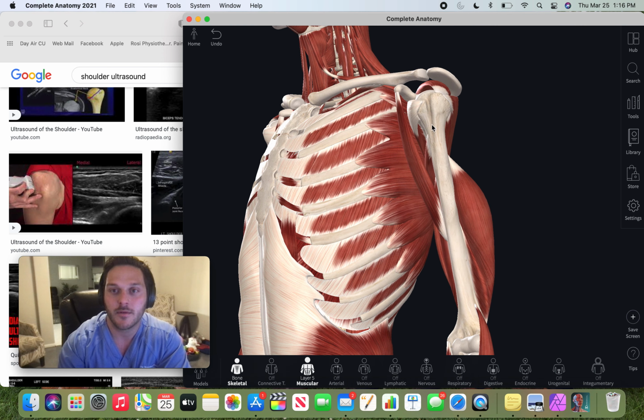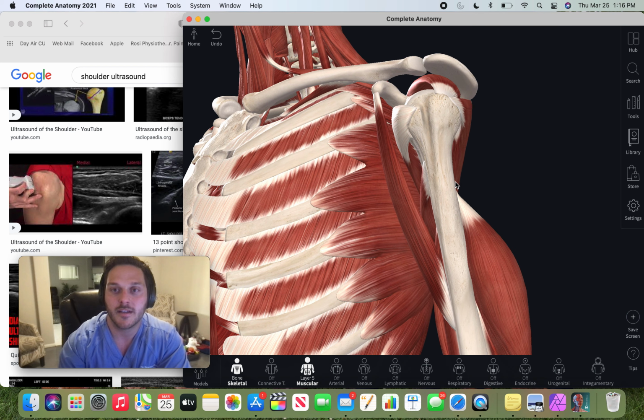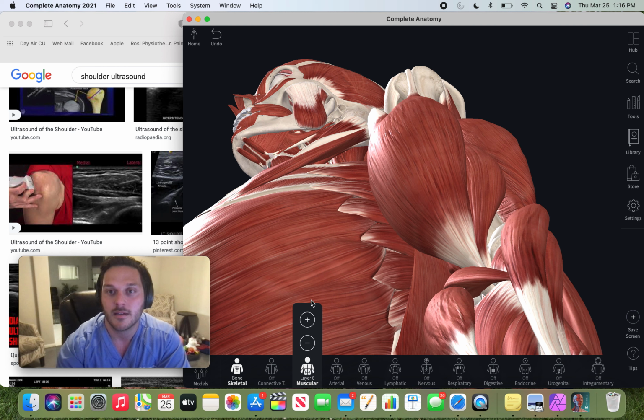So notice that we have our bicipital groove, and let's see if I can line this up the way I want it to be. The image that you're going to see is like this. We're going to have here the lesser tuberosity, the intertubercular sulcus, or the bicipital groove, the greater tuberosity. The bicep tendon is going to sit within there. Let me see if I can pull it up without making the muscles get in the way. Okay, so you can see where the tendon would have been. So that image you're seeing is just that rope. So that's just, we're cutting there.